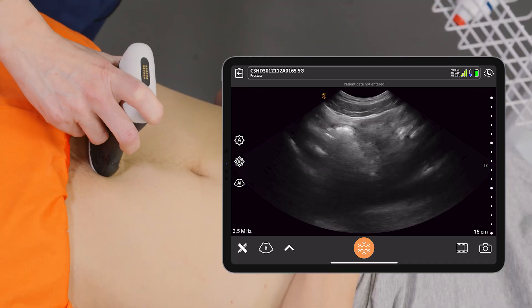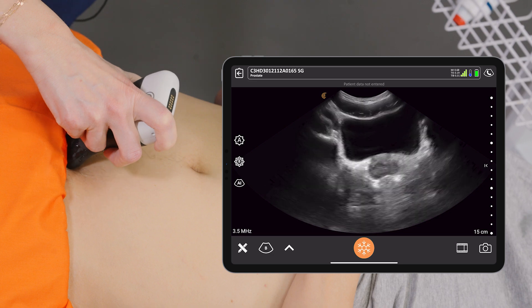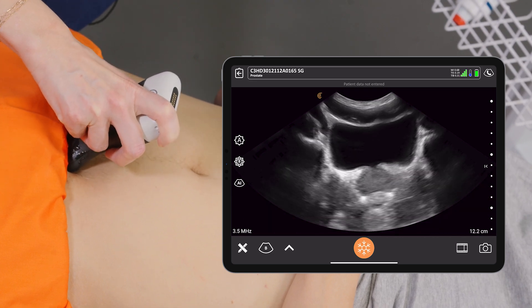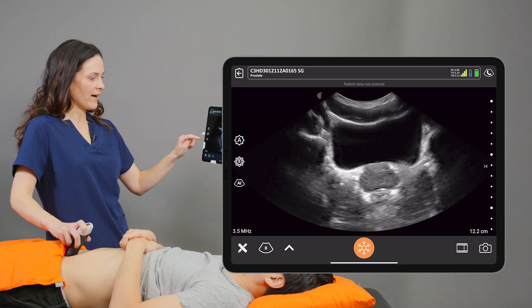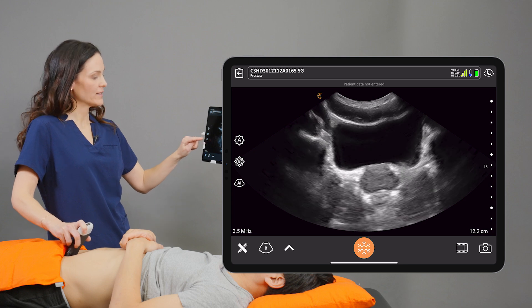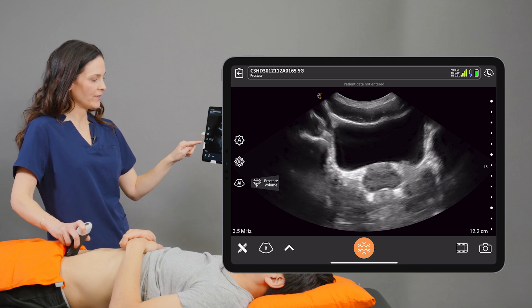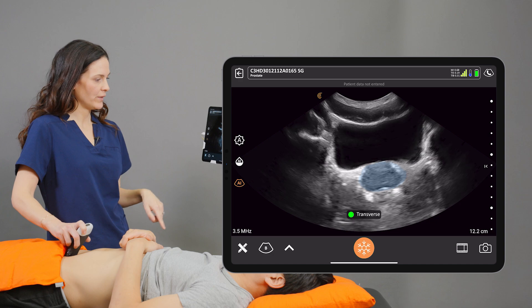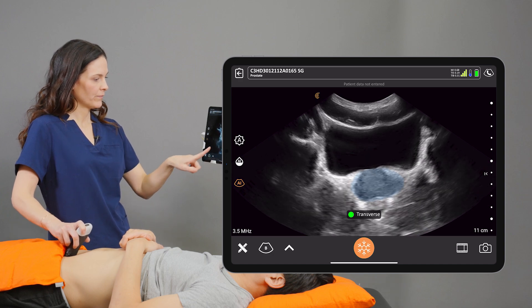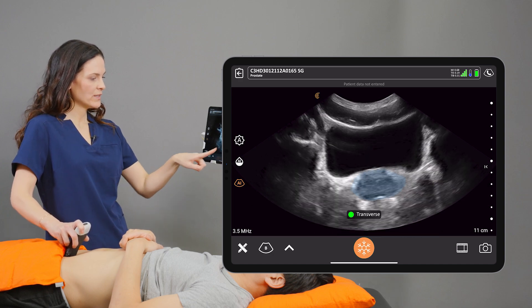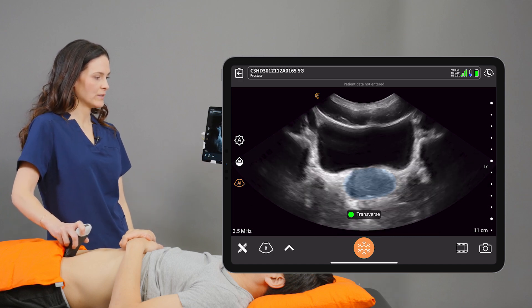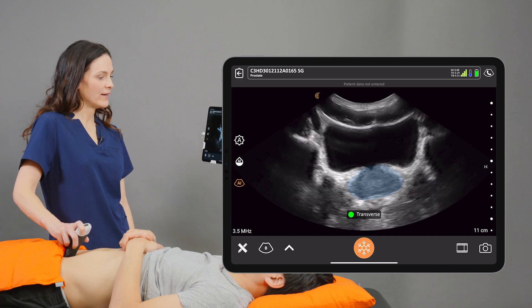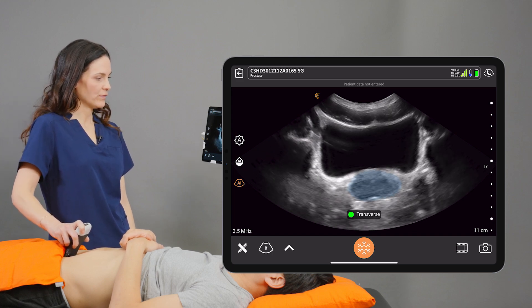I'm going to start in a transverse orientation over top of the patient's pelvis and I'll angle downward towards the patient's pubic bone. To activate the AI I'll select the AI icon on the left hand side of the screen and select Prostate Volume. The transverse label has been applied to the screen for me and the prostate has been highlighted with a masking overlay.